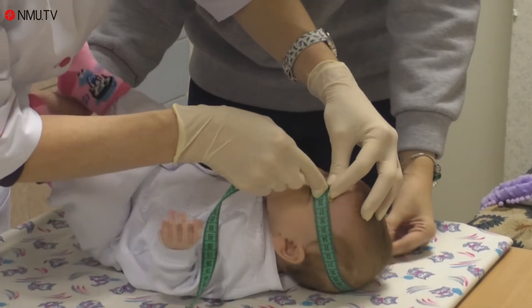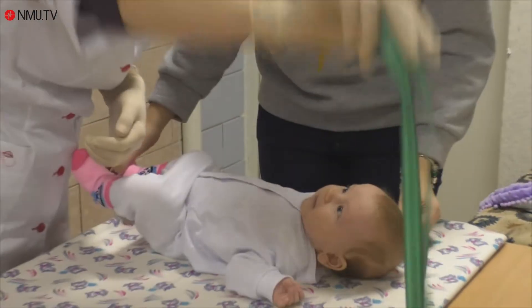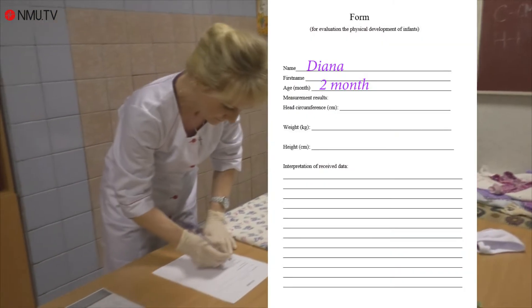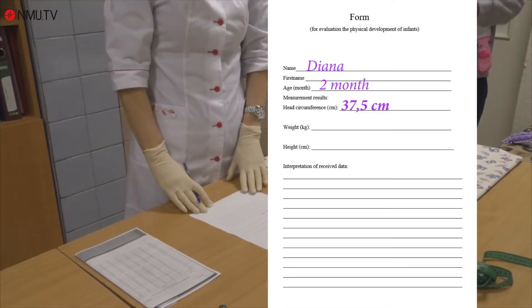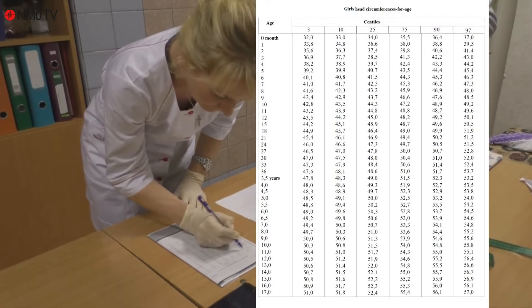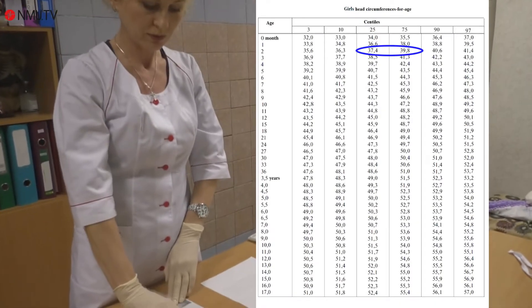Circumference of the head is 37.5 cm. Write down the results on the form and compare them with the standard centile tables. The obtained indicator falls in the range between the 25th and 75th centiles, which corresponds to average physical development.